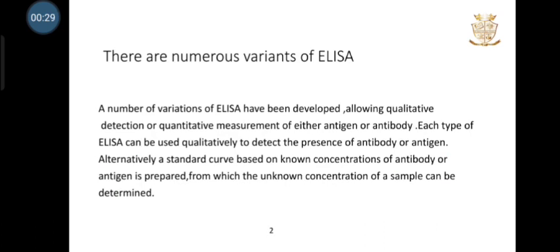There are numerous variations of ELISA. A number of variations of ELISA have been developed, allowing qualitative detection or quantitative measurement of either antigen or antibody.